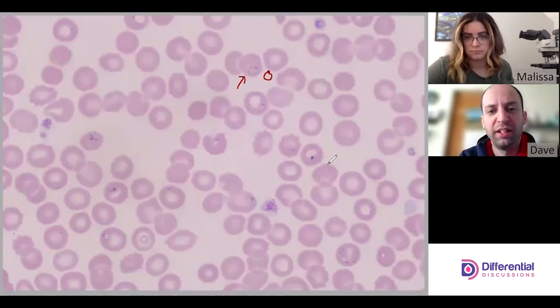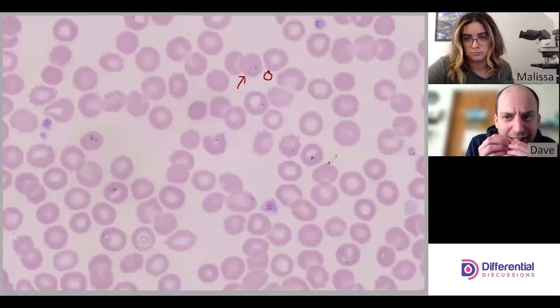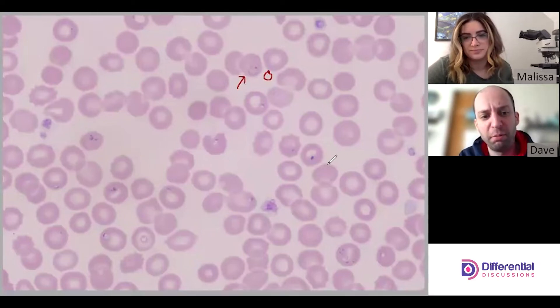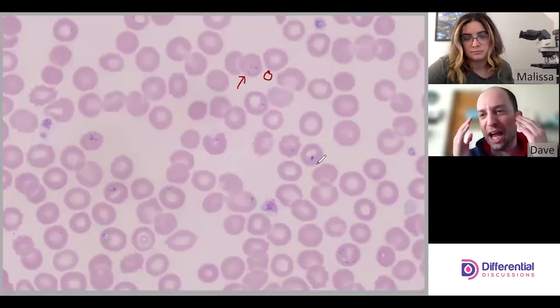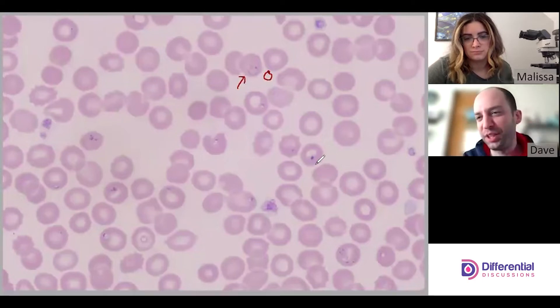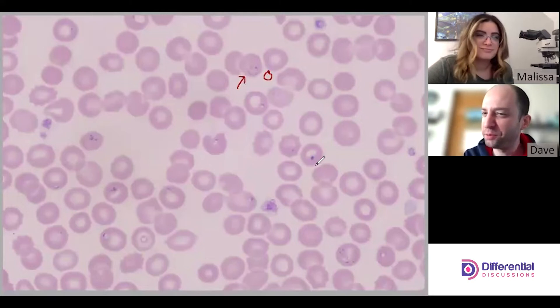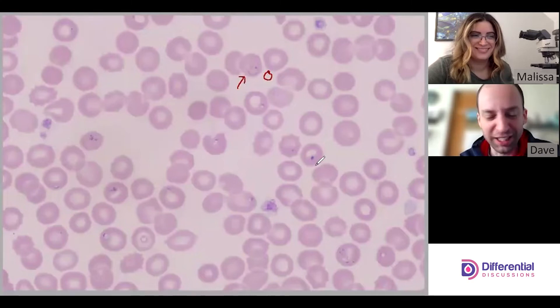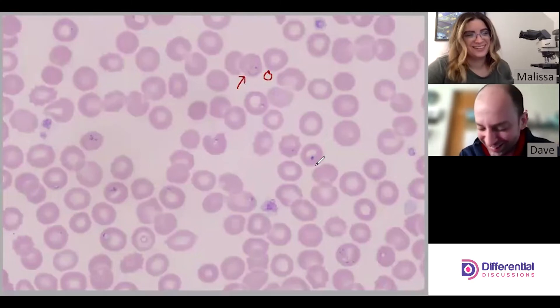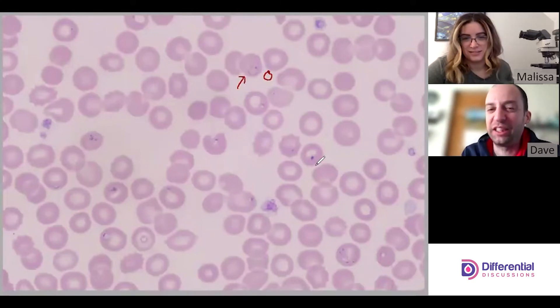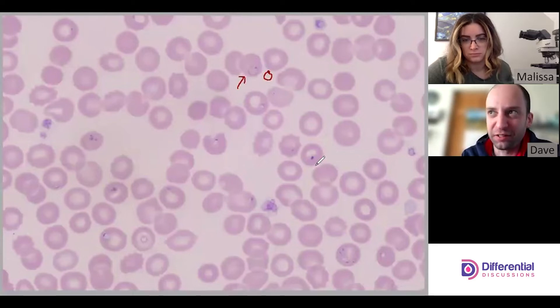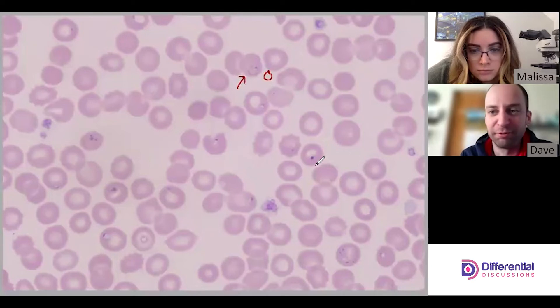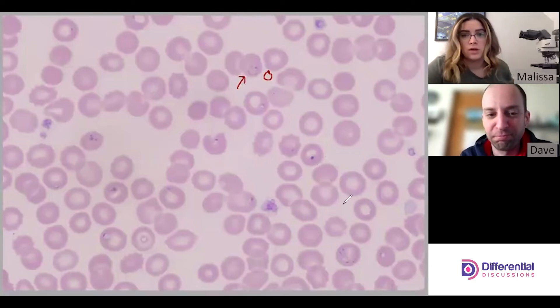Some of the other organisms can look really tightly crunched up and kind of twisted around. Babesia, once you see it enough times, becomes one of the easier ones to speciate — it just seems to be the most recognizable. We see it a lot, which is probably why.